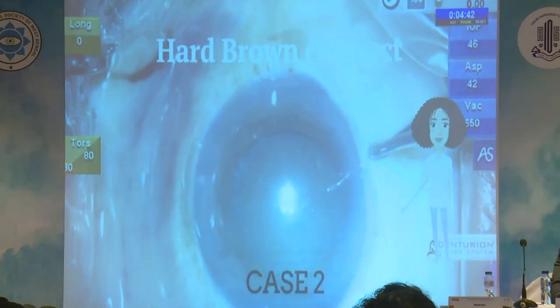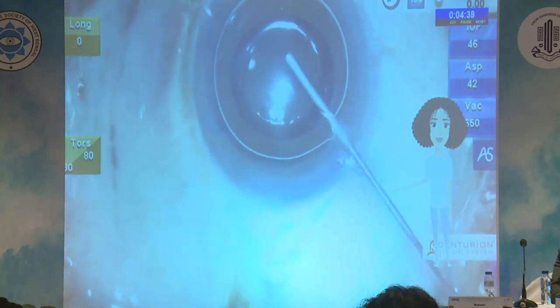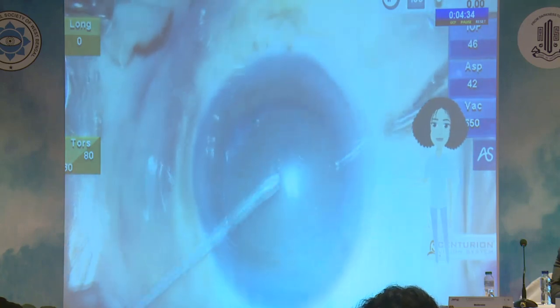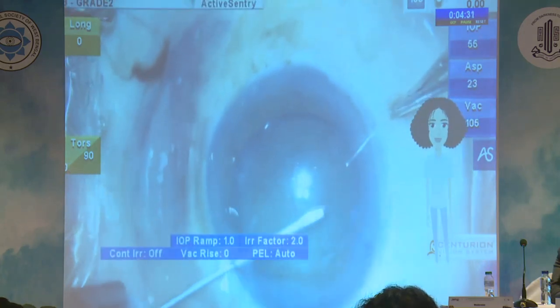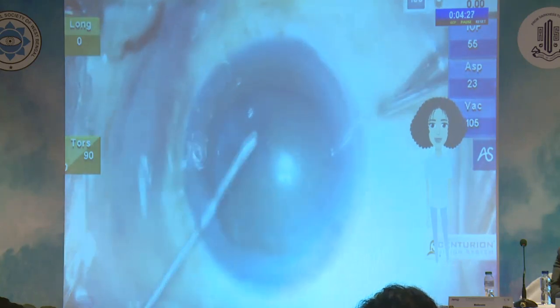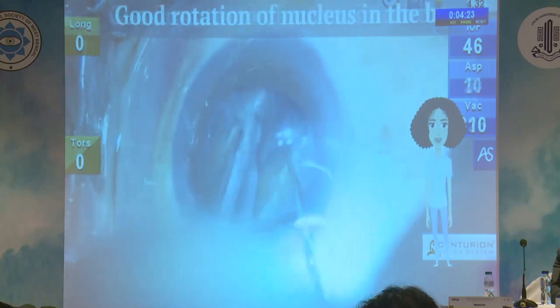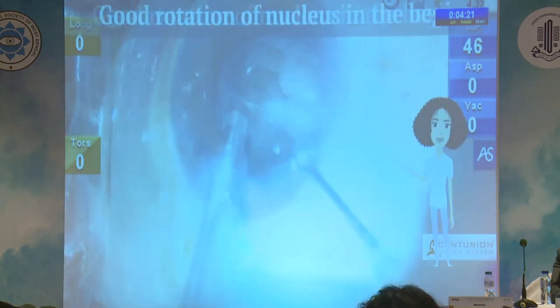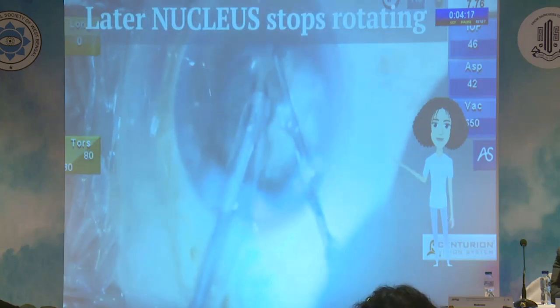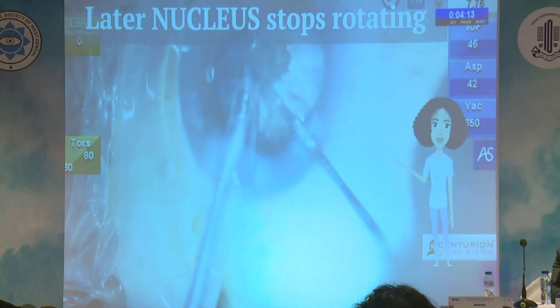The second case, a hard brown cataract with pseudoexfoliation, started off like any other normal case. The surgeon does a well-centered, continuous curvilinear capsulorhexis and proceeds with the surgery. During his initial few chops, the nucleus can be seen rotating freely in the bag. But later on, he notices that the nucleus stops rotating.